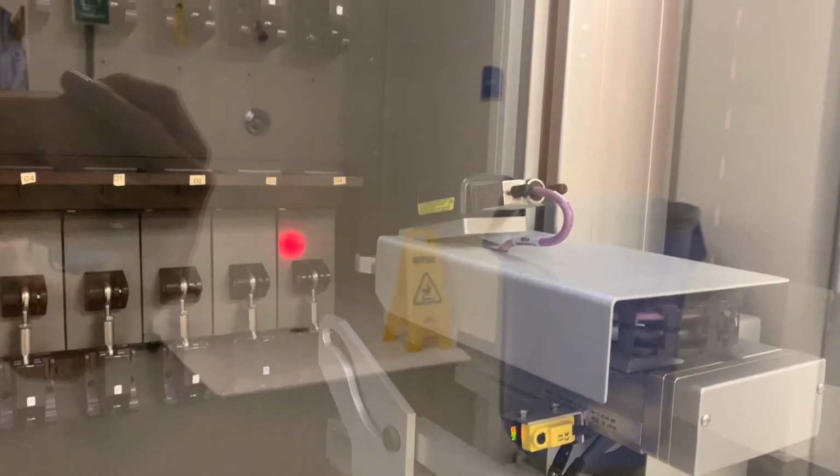Once the cartridge enters the module, it takes 30 minutes to get a positive result and about 45 for a negative result.